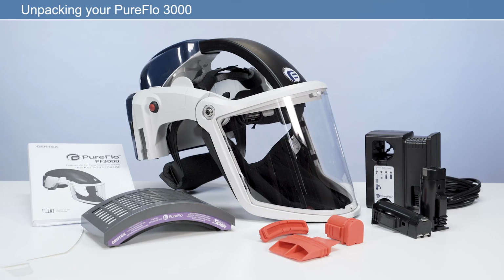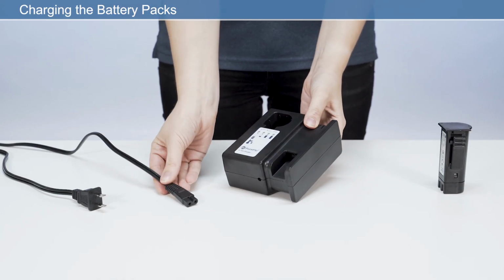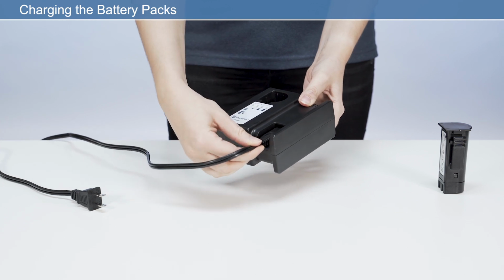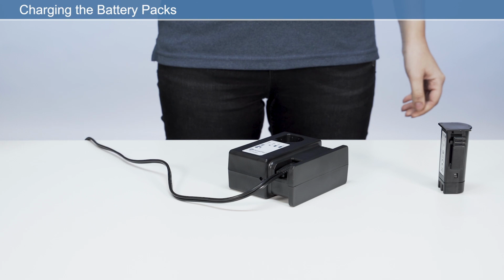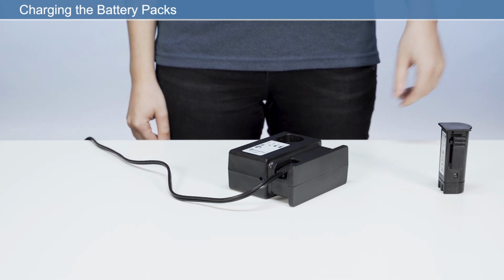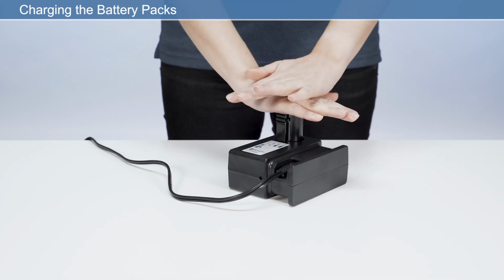Now that you've unpacked your respirator, we need to set it up ready for use. To charge the battery pack, insert the power cable into the charger and then into the power supply. Then, insert the battery into the charging slot, ensuring it clicks fully into place.